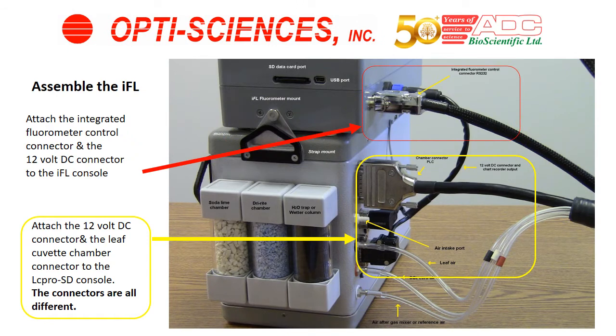Next, mount the various cables onto the various connectors on the LC-PRO SD console and the IFL console. It's not possible to put them in incorrectly, as each one of the connectors is different. You will know which one fits where if it fits the correct attachment.